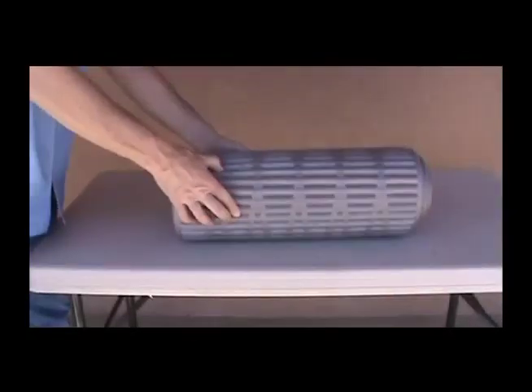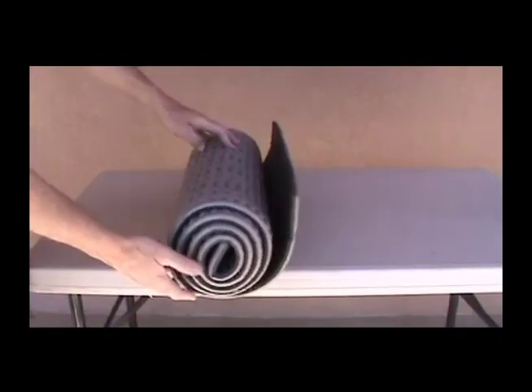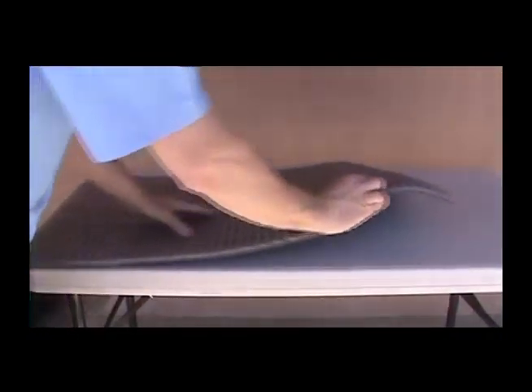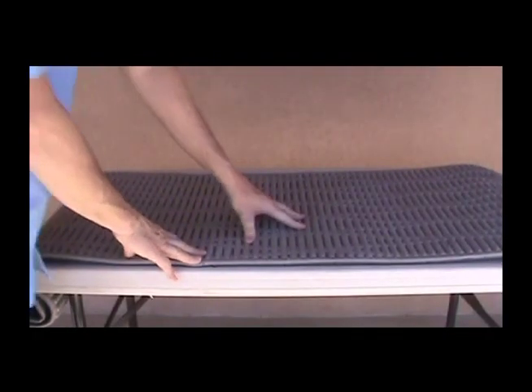I place a rubber exercise mat or camping mat on the ultrasound table. This helps prevent the cardiac table from sliding and cushions the elbow of the transducer arm.